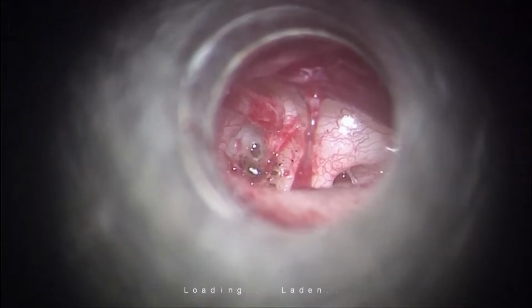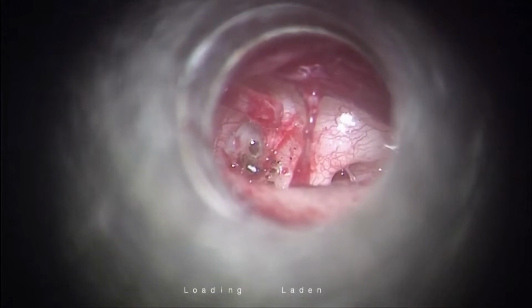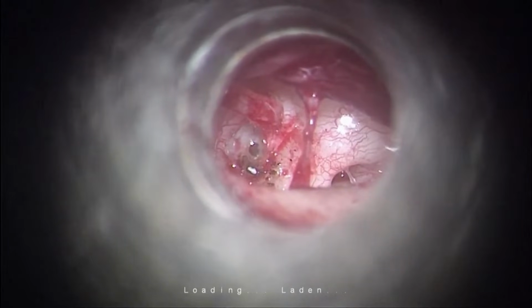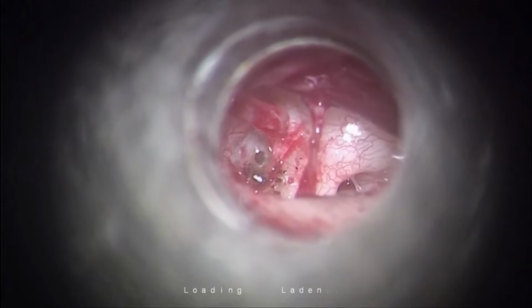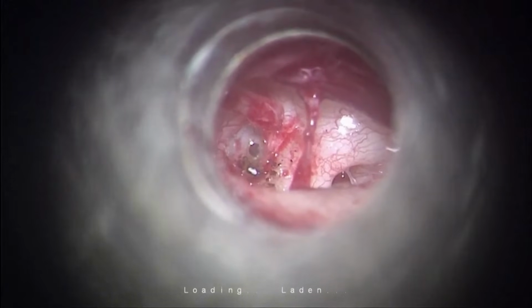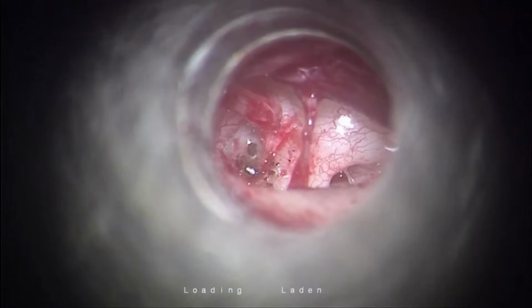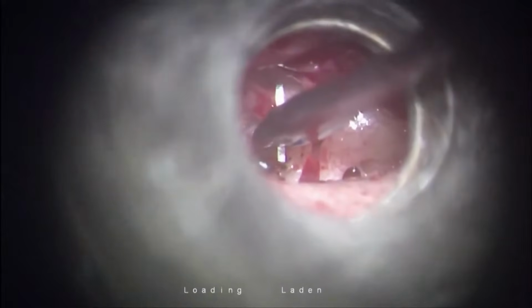The beauty is, why I say simple for beginners, there is no need for crimping. Crimping is an extremely difficult step in terms of getting adequate crimping. It should not be overcrimped, it should not be undercrimped. In the next case, Dr. Ashim Desai is going to demonstrate with his superhuman two-handed efforts his techniques of crimping. That is something he can do, which I can never think of doing, which he is going to show you. Now see the simplest aspect of piston placement.